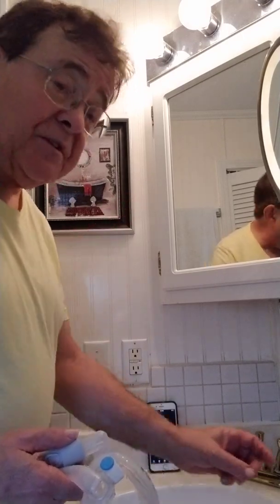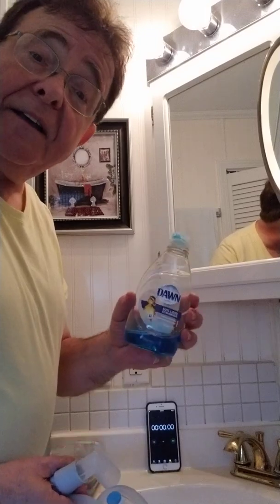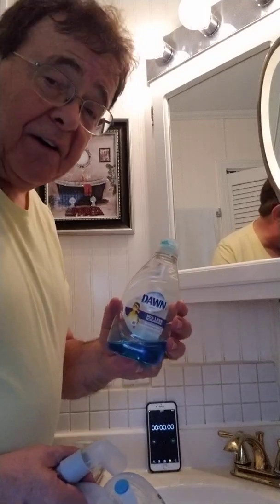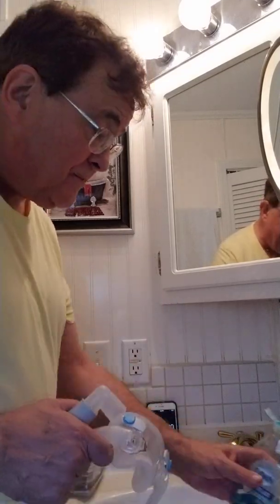The first thing is, I went through the ResMed documentation, and it tells you to use a mild detergent. You think about it, a dish detergent was made for cleaning dishes. And I use Dawn. Dawn is a very good mild dish detergent. So this is what you're going to see me do.